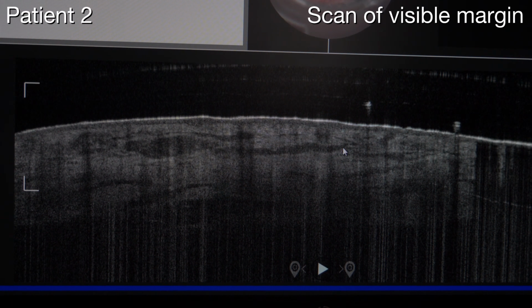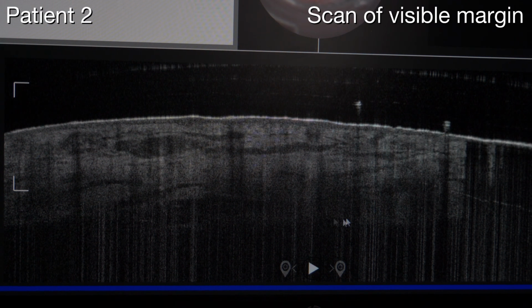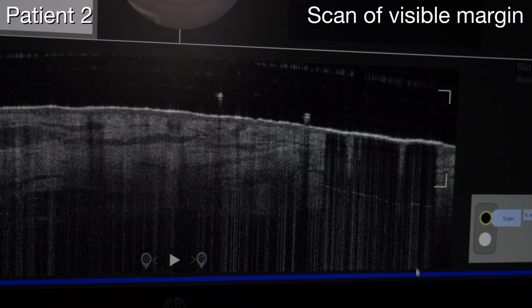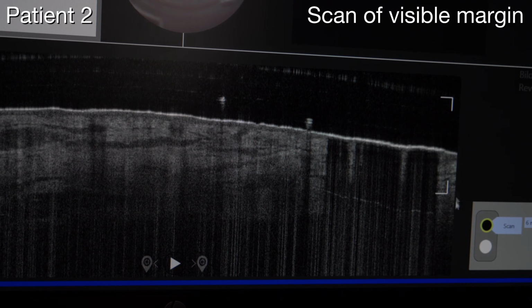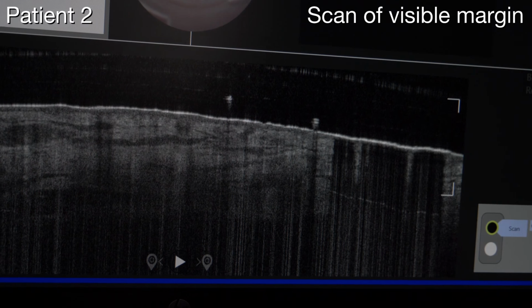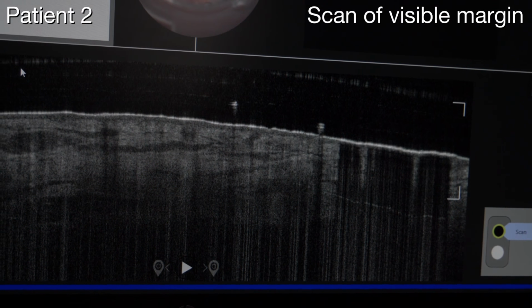This is a big blood vessel, a serpiginous one, but this one is a nodule. And here you can see the demarcation of the pen and the shadow, and here is the healthy tissue. Here is inside the tumor, here is the shadow of the pen, and this is outside and should be healthy skin, but it isn't. And this is why I added a safety margin.